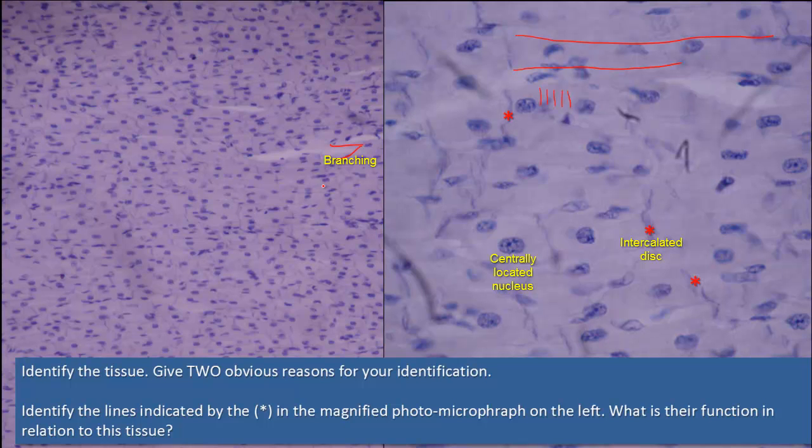The intercalated discs are involved in conducting electrical impulses through the heart in order to support the synchronized contraction of cardiac tissue. In addition to anchoring junctions, the intercalated discs contain gap junctions. These are also called communicating junctions that allow the action potential to spread between cardiac muscle cells, because these gap junctions allow the passage of ions between cells, producing depolarization of the heart muscle as a single functional organ or as a syncytium.